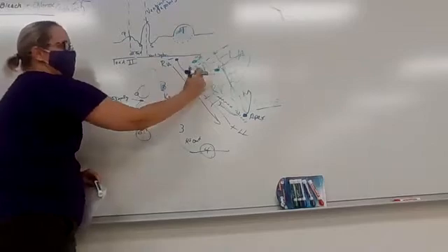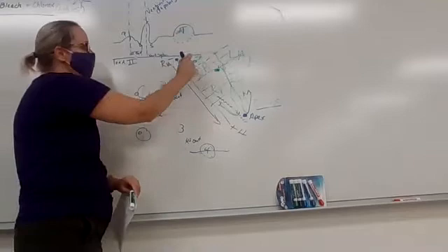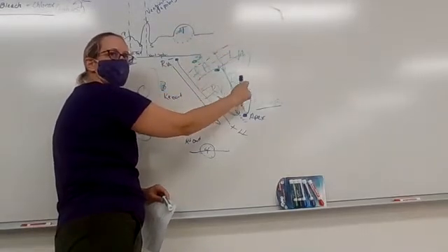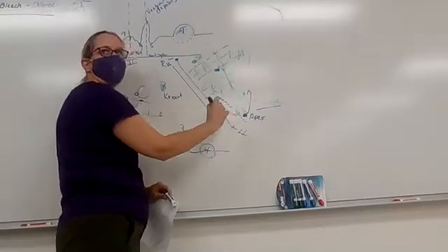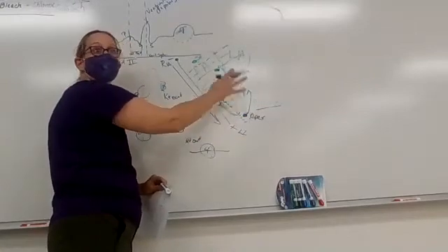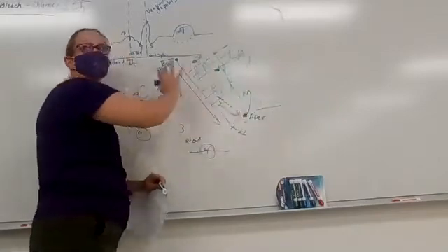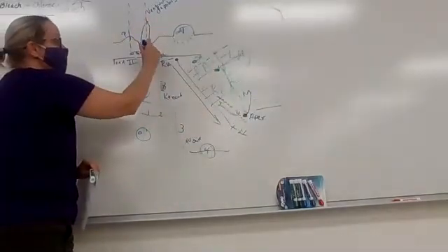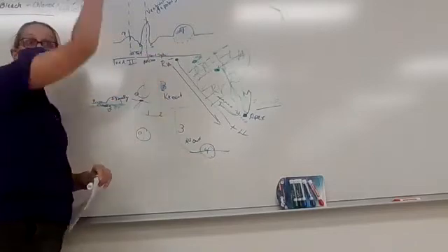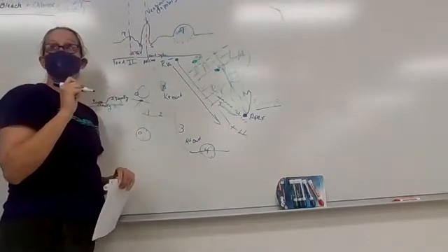All right. The QRS complex is going to represent when my ventricle is depolarizing. Okay? So it represents that the AV node hit threshold. The AV node sent the wave of depolarization down the bundle, through the branches, through the moderator band, through the Purkinje fibers, got the ventricle contractile cells to start to depolarize, got the papillary muscles to start to depolarize, and all of those cells are now depolarizing. So again, what's going to start to happen? My AV valve should close because the papillary muscles are going to pull it. My ventricle is now going to enter systole.